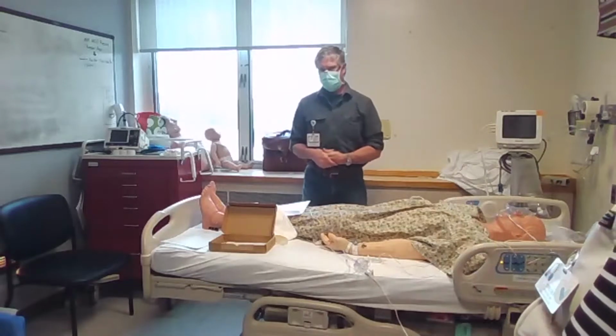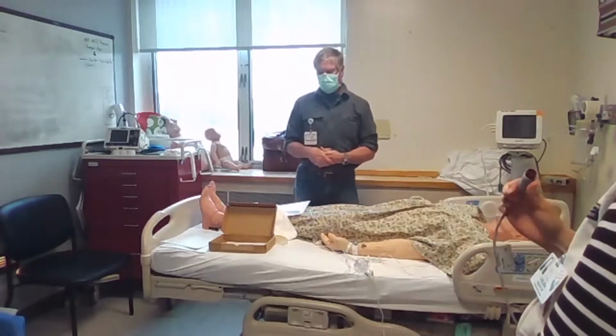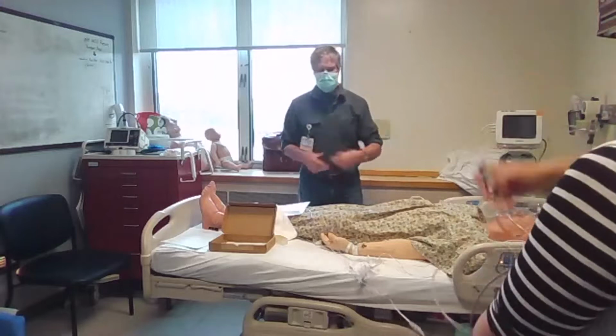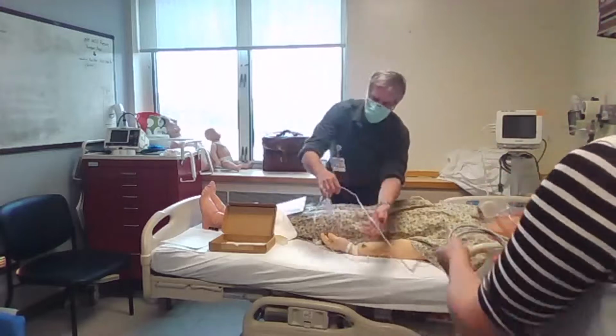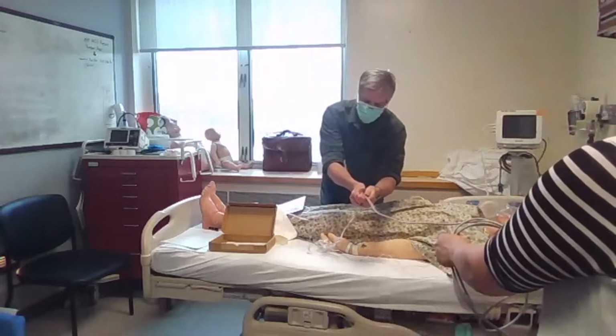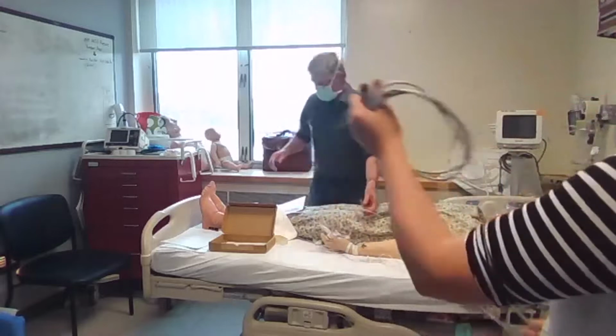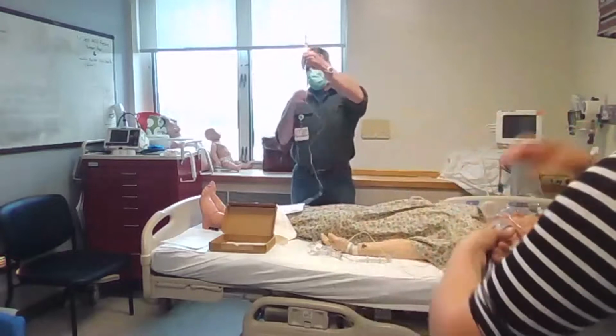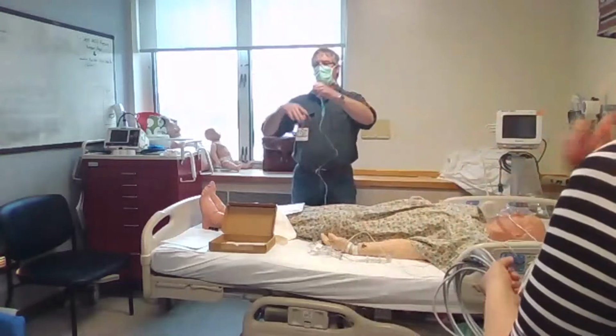Yeah, I think room 2 does. Okay, any questions about the way that it works? If that helps. I always think knowing how something works helps a little. So you have to blow up the pressure bag. Yes, so you turn off the flow because you don't want to get bubbles.